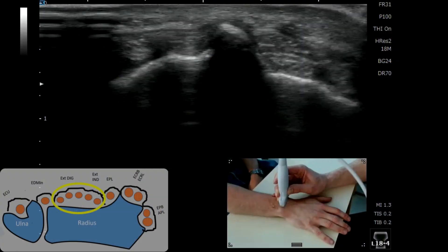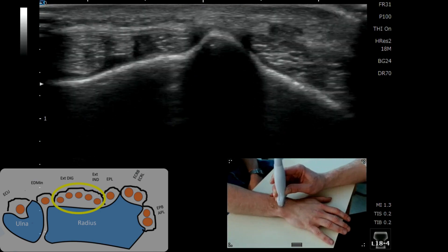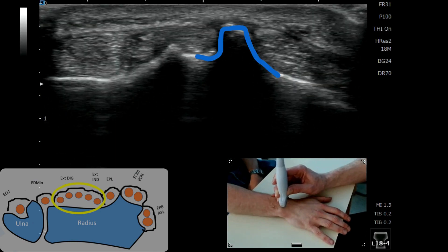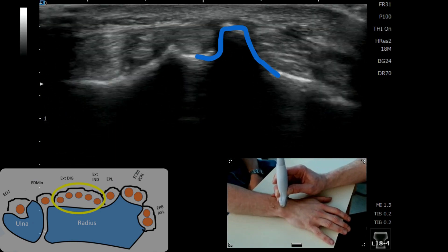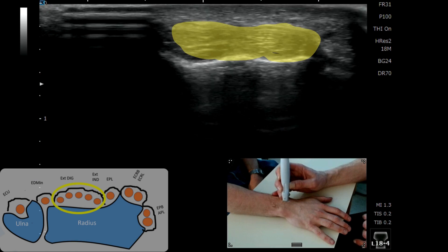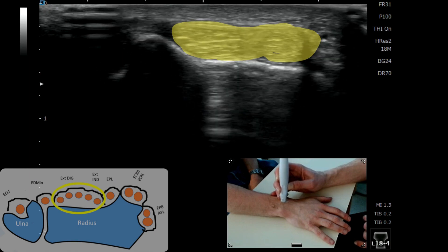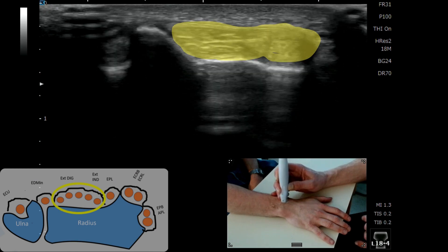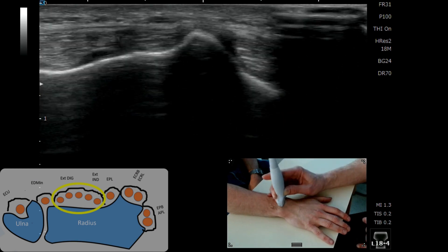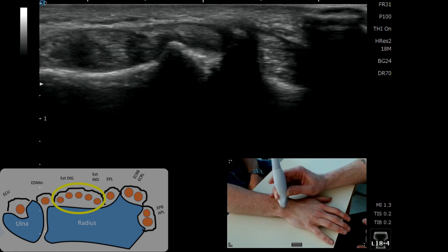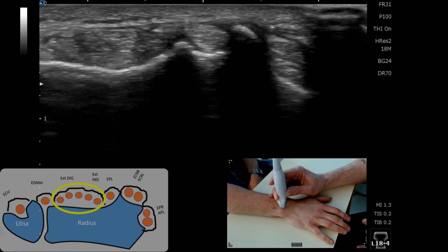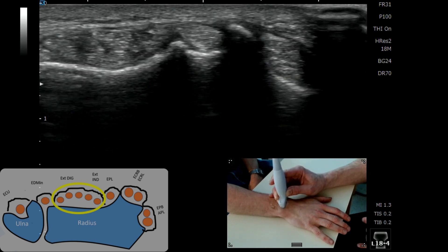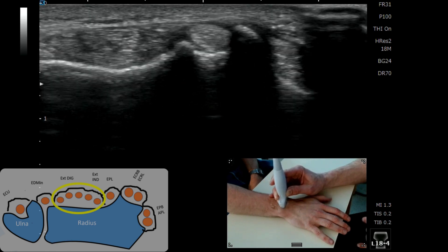We've come onto the dorsal wrist — there's Lister's tubercle. To the radial aspect is the second compartment with ECRB and ECRL. Coming across to Lister's again, the next compartment is three, which is EPL. If I get the patient just to wiggle their thumb — perfect.